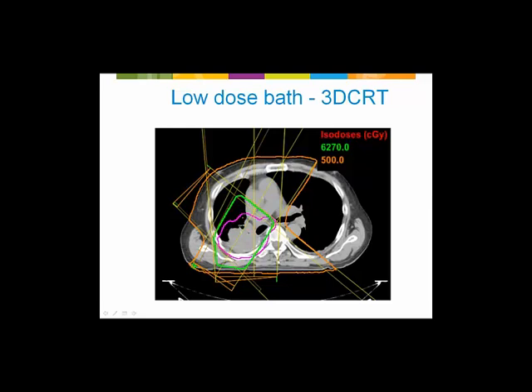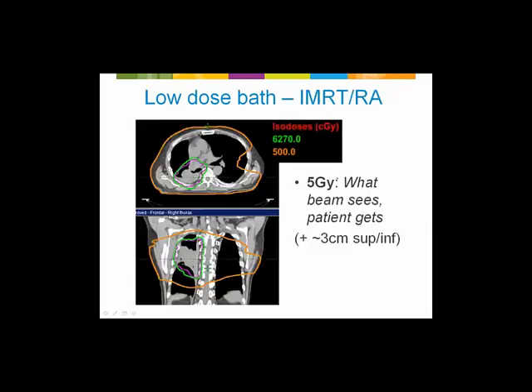Now, IMRT or RapidArc approach. Normally when we start with a fixed beam IMRT approach, we do something that's very sensible. We put on equispaced beams as our default beam arrangement. Why? Because it gives the optimization the most flexibility to optimize dose in the patient. When you do this, like in lung, you end up getting very nice conformality of the dose to our target.